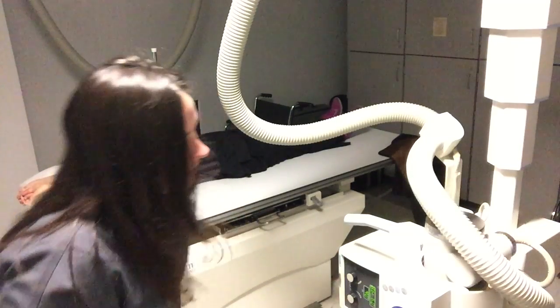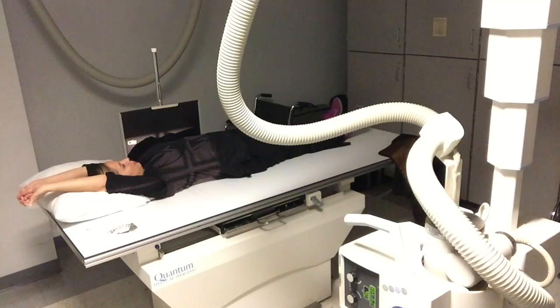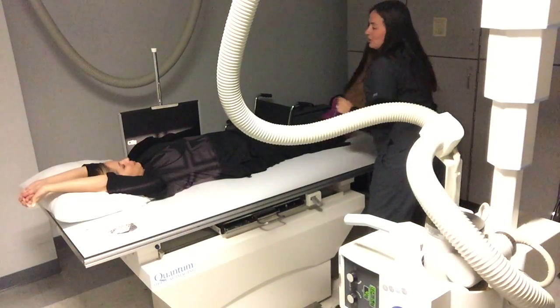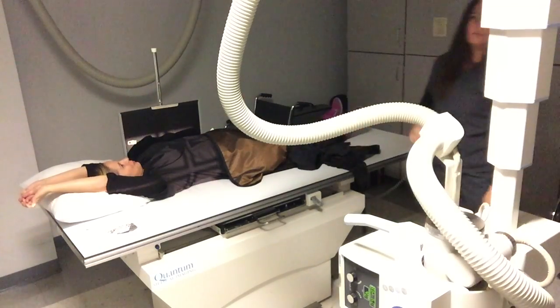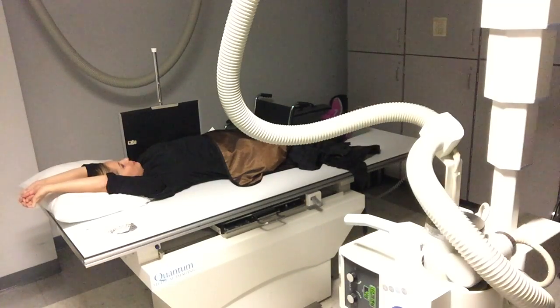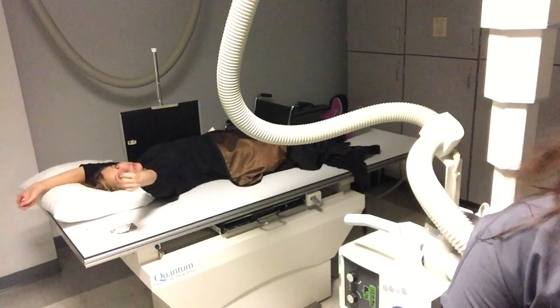I'm checking my SID one last time to make sure I didn't manipulate it — I'm good right there. I'm at 120 kVp again for this one. I'll have her take in a deep breath, blow it all the way out, take in one more deep breath, and hold while I make the exposure. Never forget the shield, even if it's last minute. Those are your two additional final-only chest projections.